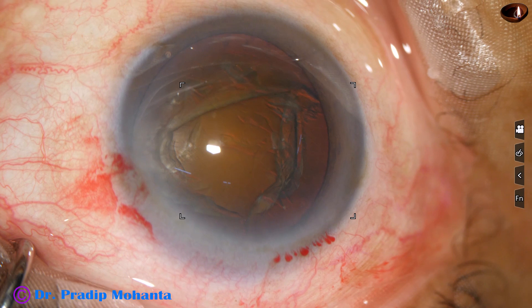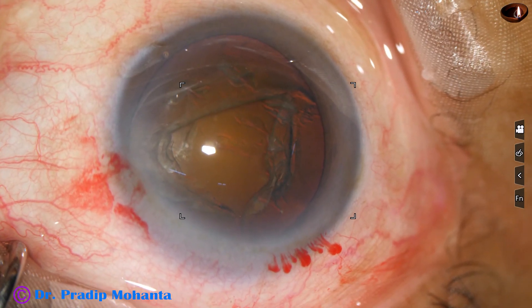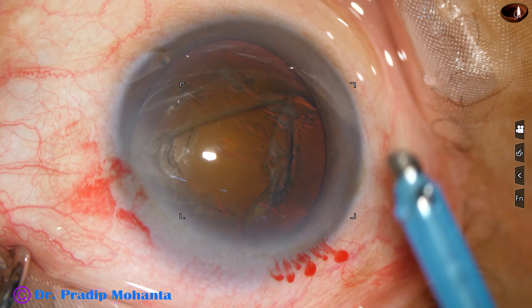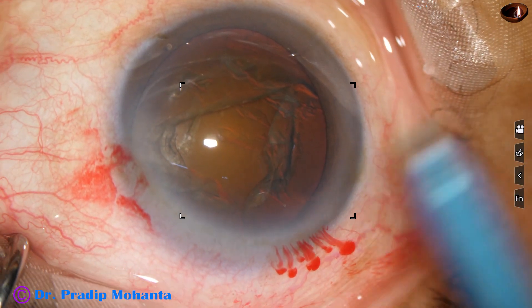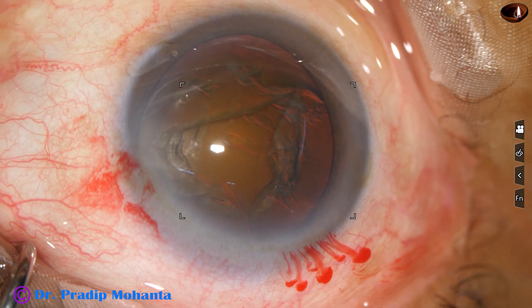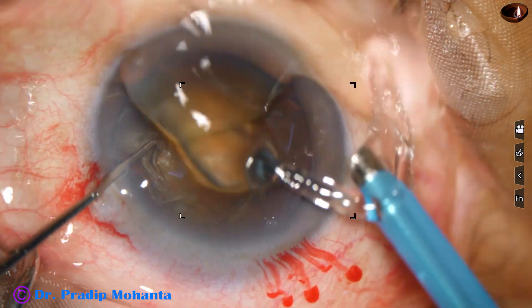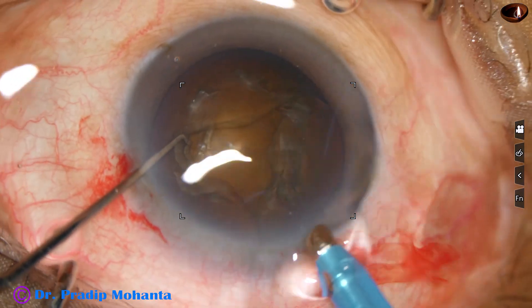And now it is time to introduce the phaco handpiece into the anterior chamber. In such cases, the exposed part of the tip is a little more than other cases. And in such cases, I do submarine chop.